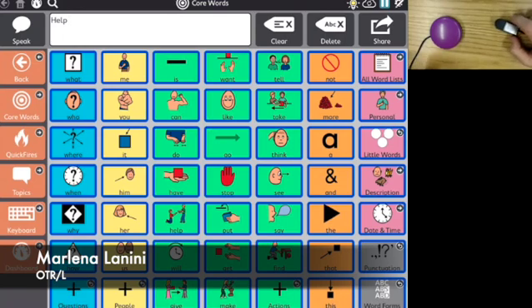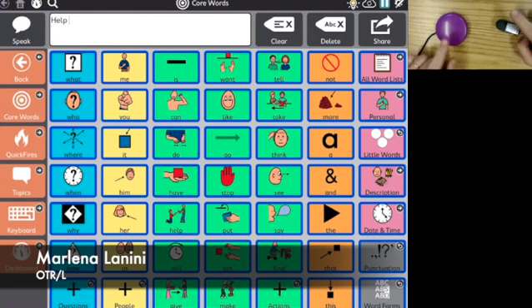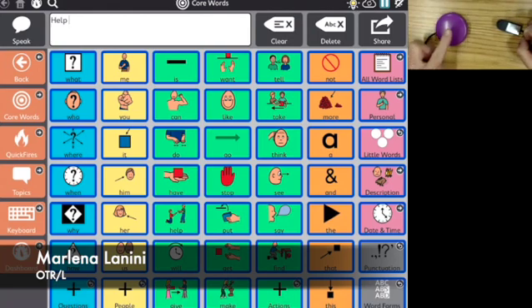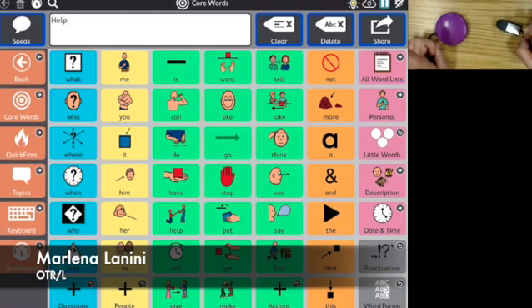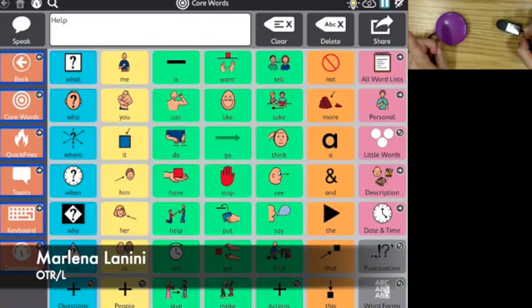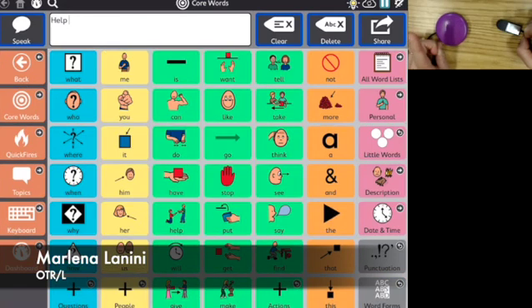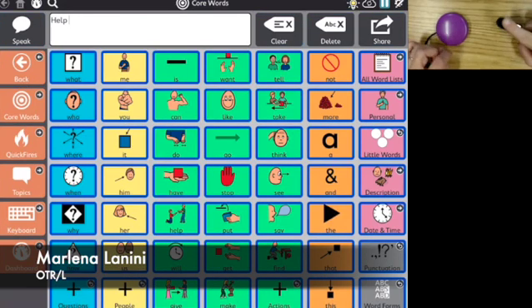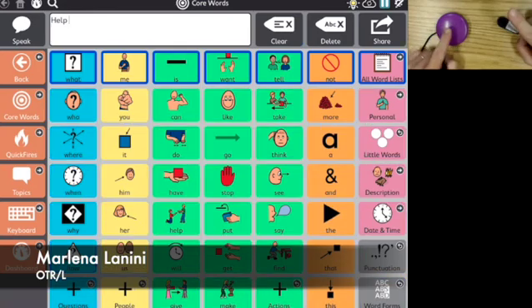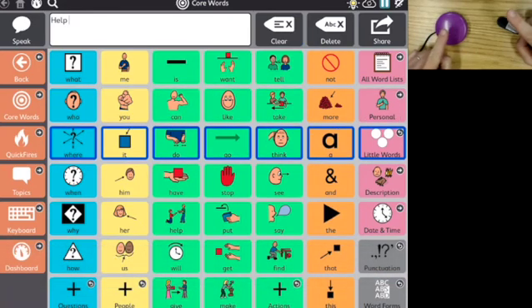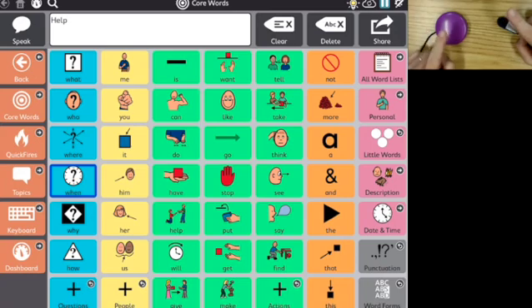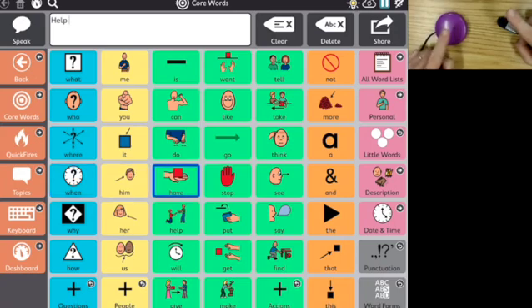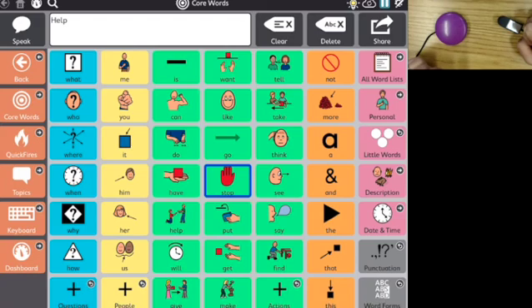I can use one switch to step through my options. You can see that is stepping through all my communication options. The second switch will be my selection. So now I'm going to move down my rows and select.